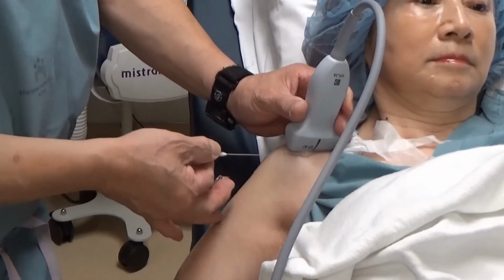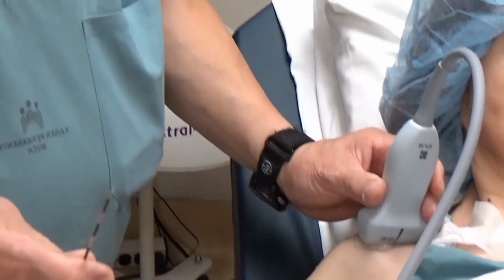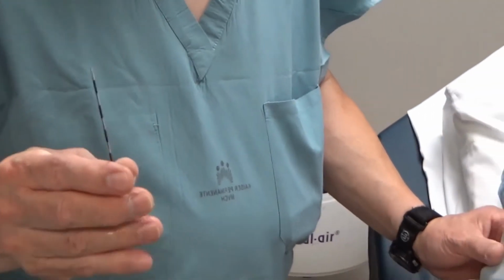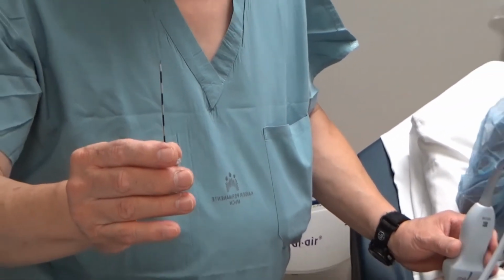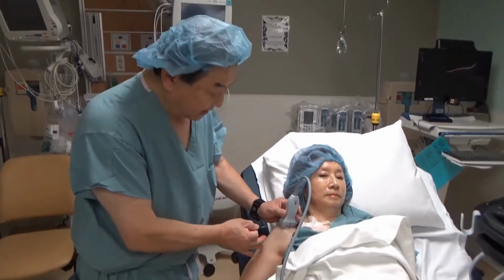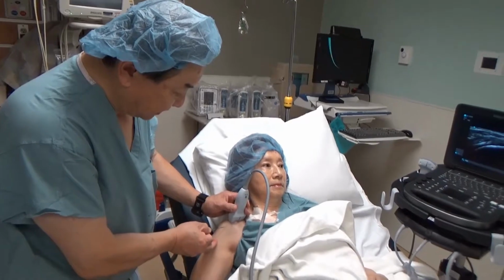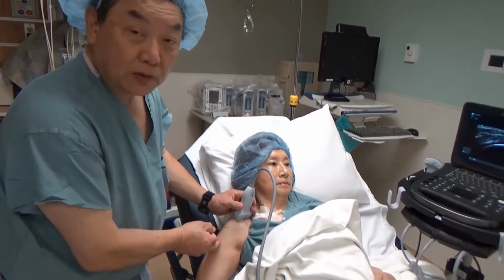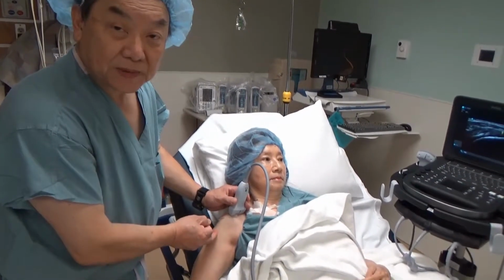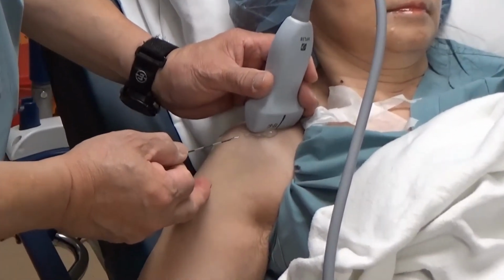After the skin is anesthetized, we will take a Tuohy needle. I usually use a 14 gauge or 16 gauge Tuohy needle, and then over where the anesthetized area is, I advance this Tuohy needle into the supraspinatus tendon to contact the calcium deposit.